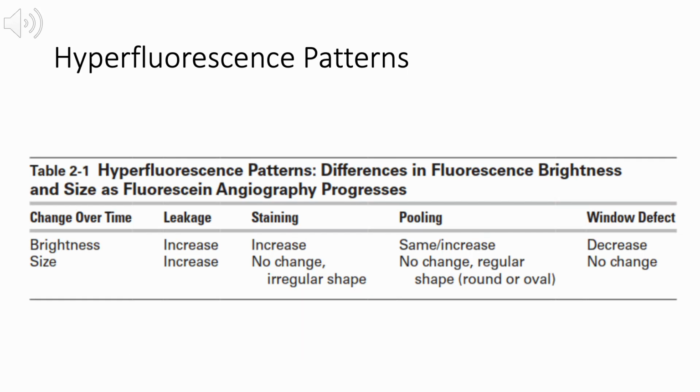To consolidate the fluorescein angiography patterns just discussed, this table summarizes the key differences in brightness and size over time among the four classic hyperfluorescence patterns. Focusing on how these features evolve as the angiogram progresses helps distinguish one pattern from another in practice.